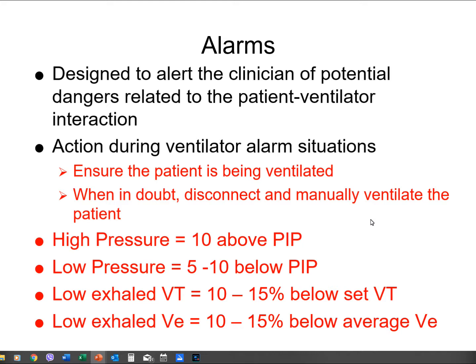Now, in clinical, do we do that? No, we don't. Alarms come in, maybe you might need suctioning. Or you watch the patient. They might be biting the tube. There might be a kink in the endotracheal tube. They might just be coughing, and it's causing a high pressure alarm to go off. You never know. But you want to make sure the patient's taken care of first.